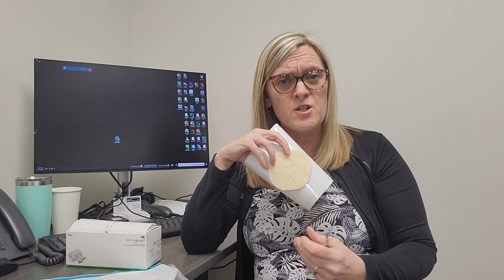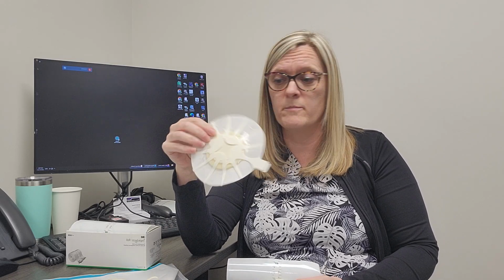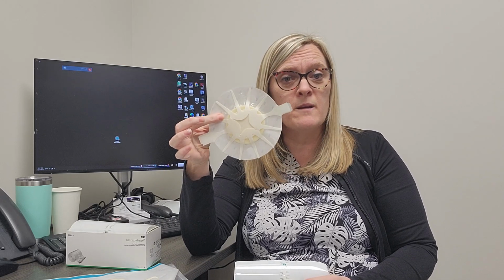So when using only one layer, the film is actually semi-permeable, so it will allow for some fluid loss to come out the back of the foam, and it doesn't entrap it. That's the main reason why they don't want us to put tape on the back of the foam, because that's how it works. It does allow for some of the fluid to evaporate off. So again, we know this from use of negative pressure therapy for many years, and how it's semi-permeable, as well as what the composition of film is anyhow. But then you can end up making this.